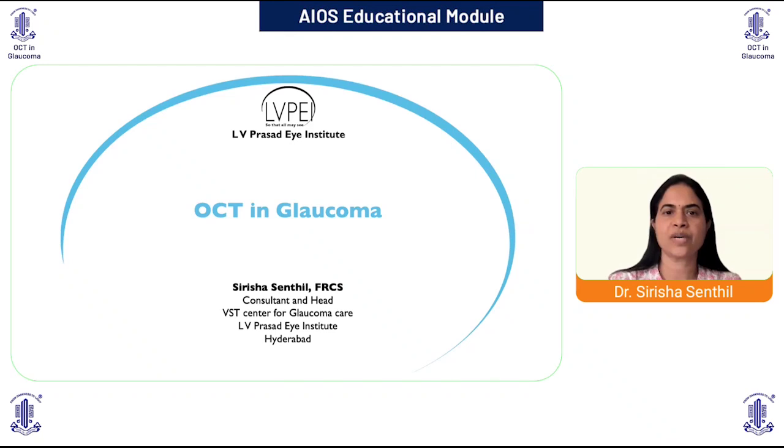I'm Dr. Sirisha Senthil, consultant and head of glaucoma service at LV Prasad Eye Institute, Hyderabad. Today, I'll be taking you through a few case scenarios where OCT helps either in the diagnosis or ruling out glaucoma, and also trying to make an alternate diagnosis in certain conditions.